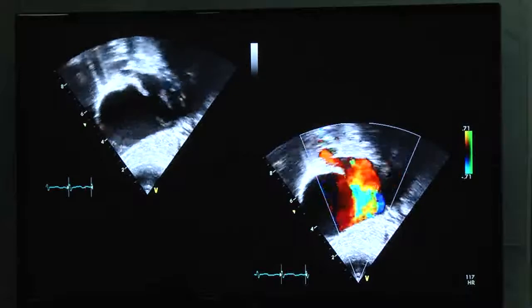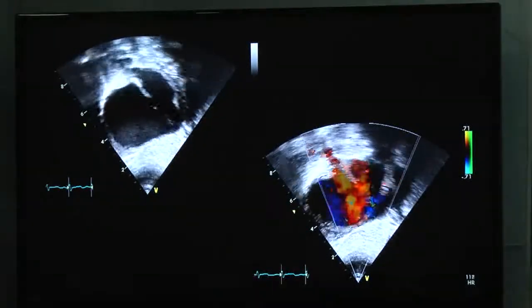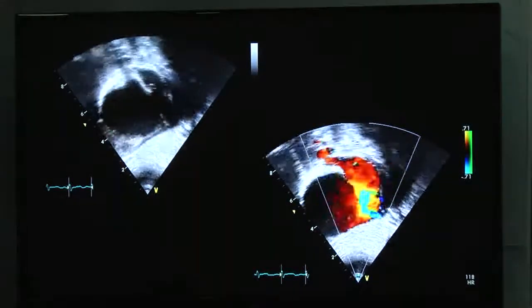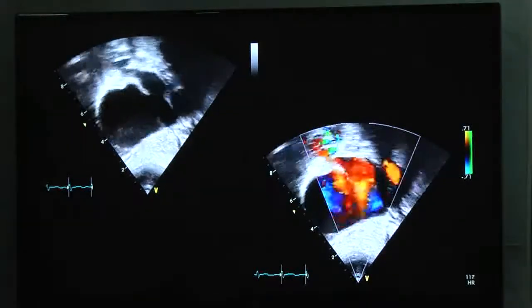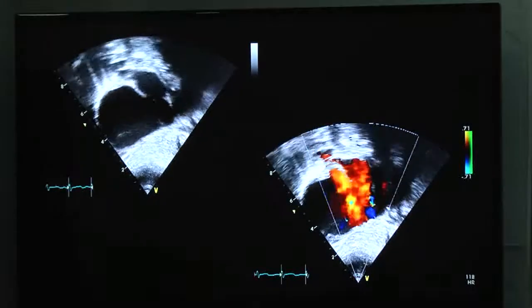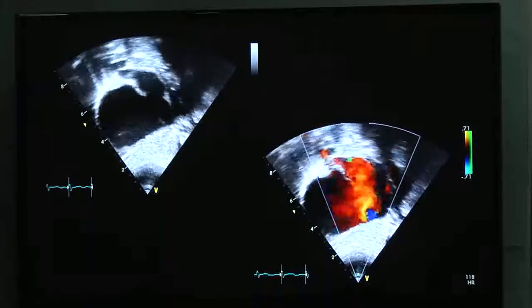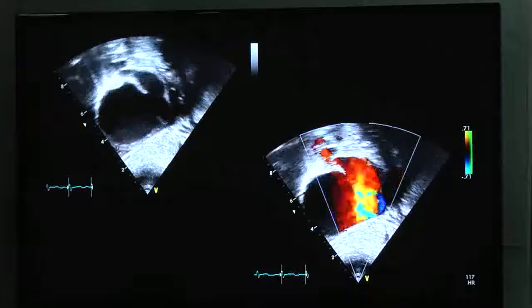I think in some cases, I'll just show you a brief. This is transthoracic, but you get in the transesophageal as well, the IVC rim is deficient. The SVC is coming from the top. This is like a bicaval view which you get. So the IVC rim is almost absent. So this is I would probably say better for surgery. So if you're doing your intraoperative assessment, then this is what you need to look for. You need to look for IVC rim.